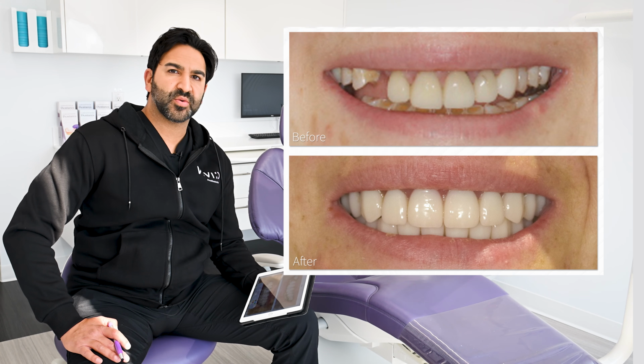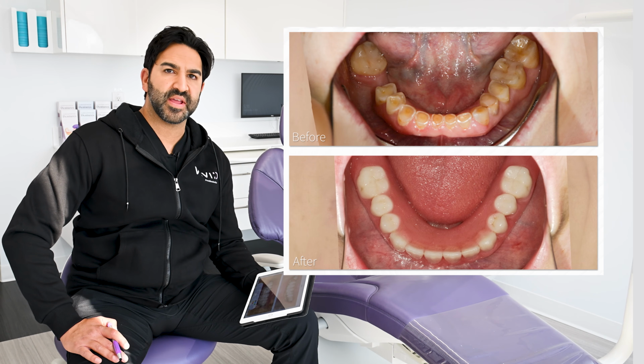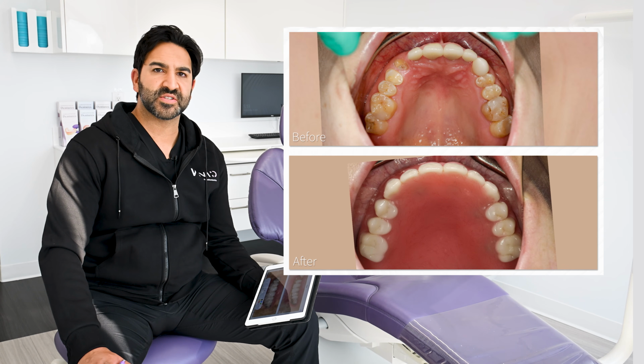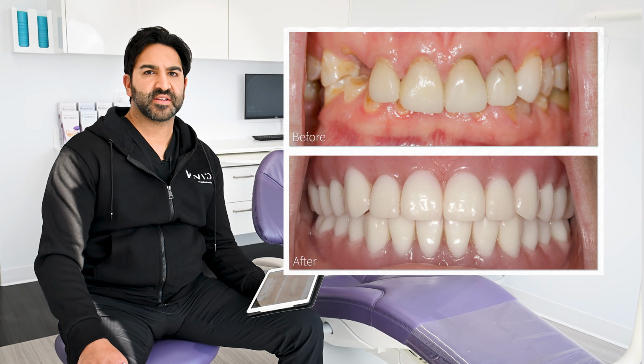This patient presented to our office with dental frustration and significant sensitivity and pain. We were able to provide her with a result that restored her aesthetics, smile, and confidence. We finished this patient's treatment in 2023.